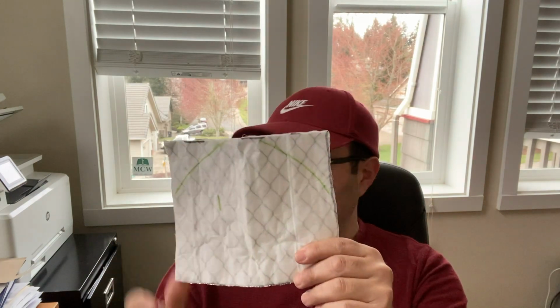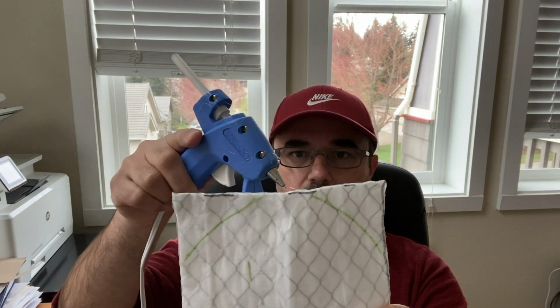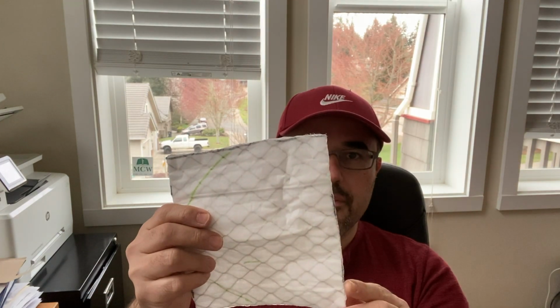And once you've done that, then the very next thing to do is grab your glue gun and put a thin layer of glue along the entire edge of this. The reason for that, and I've learned this the hard way, is that the edges of where you've cut the filter expose the aluminum frame, and this is very sharp, and you'll cut yourself. I know that because it happened to me. So I started putting this little thin rim of glue along the edges. So go ahead and do that.